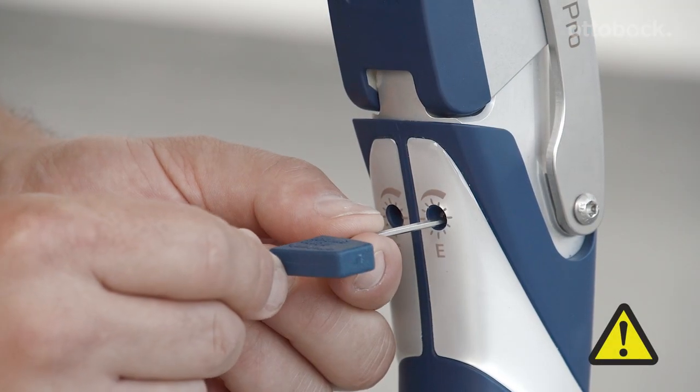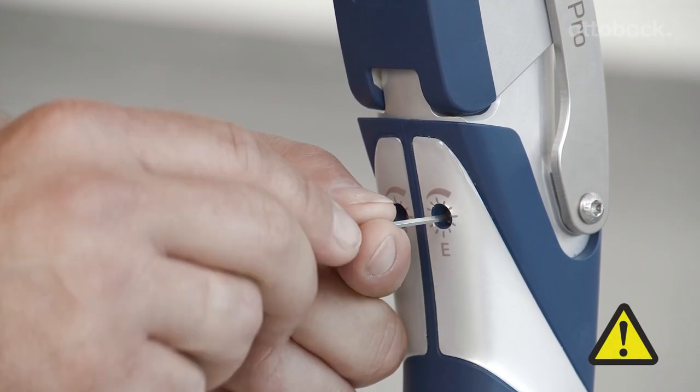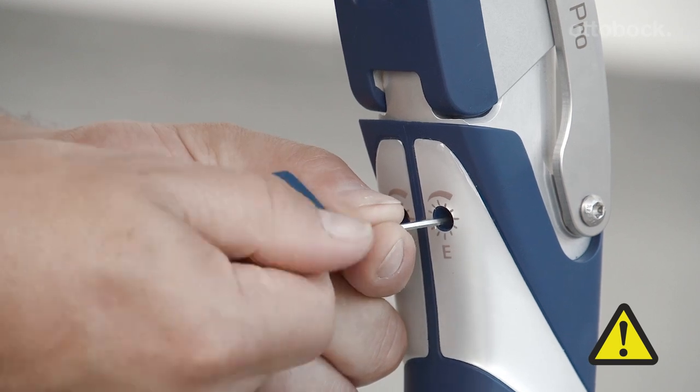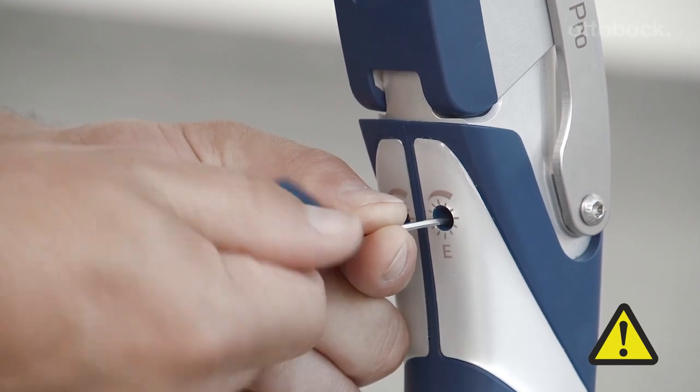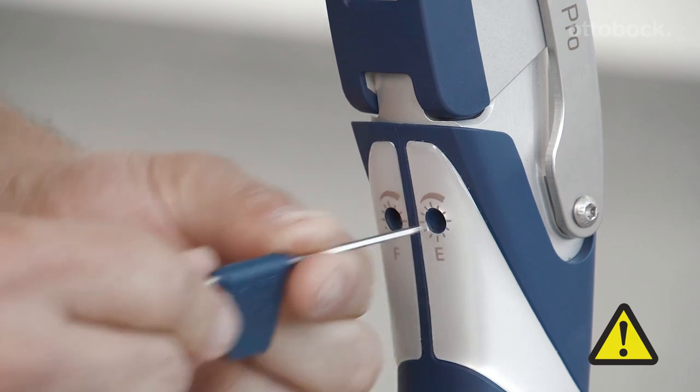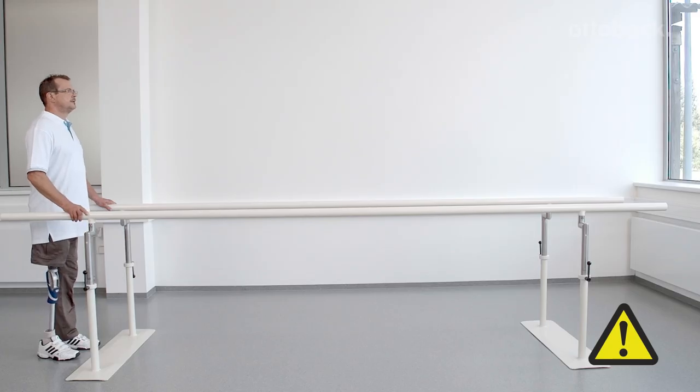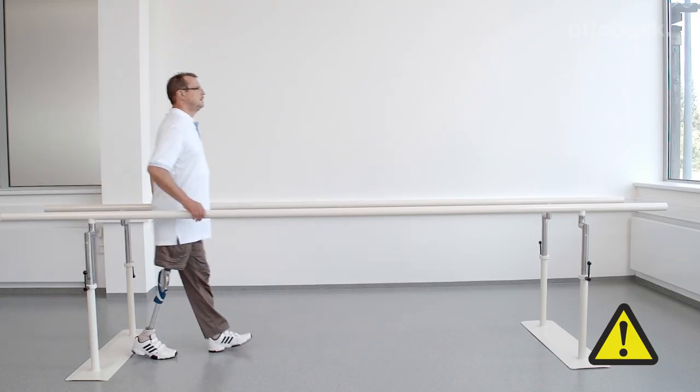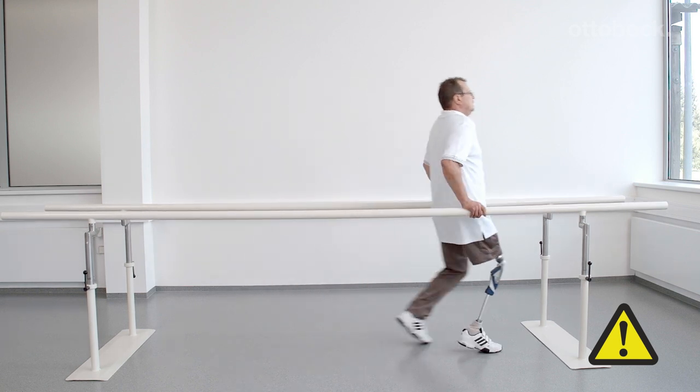It's important to always take small steps when adjusting away from the factory settings for minimum extension damping. As shown here, an extension damping set too high means that the knee joint no longer comes into full extension, which could lead to a fall.